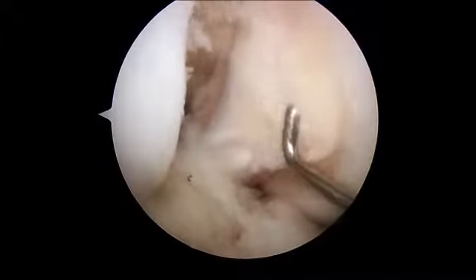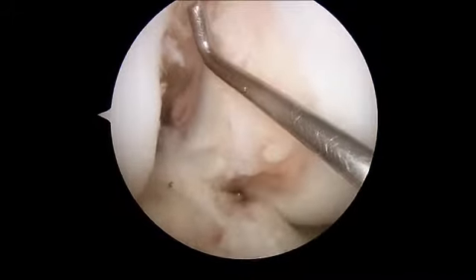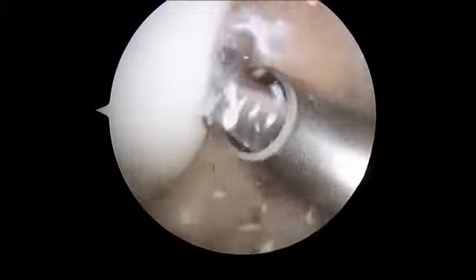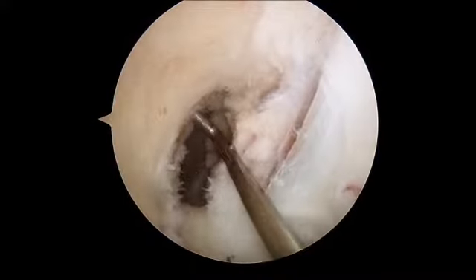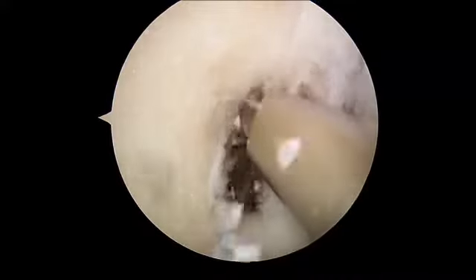All right, here we are in the knee joint, and this is the notch of the knee. And you can see this is a narrow notch, which is one of the reasons that females tear their ACLs more than males. So the first step of the procedure is called a notchplasty. It is taking the notch and widening it, so now we can see all the way to the back of the knee, and our new ACL will not hit that notch, which is why an ACL tears.